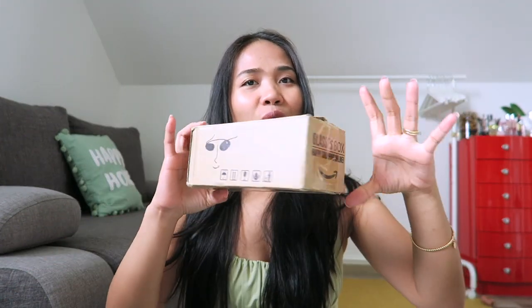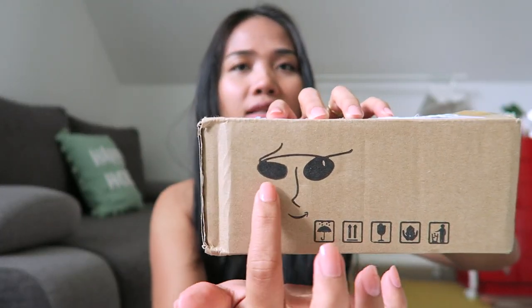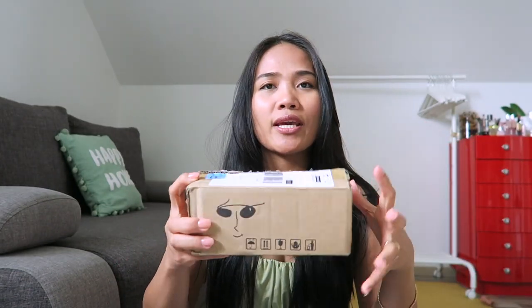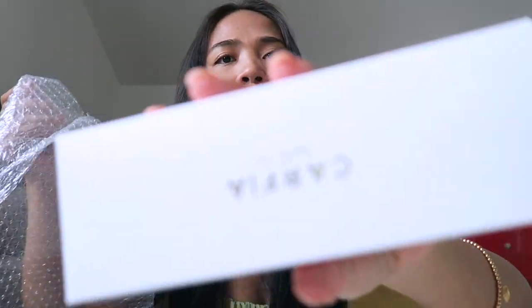Koala AI sent me a prescription glasses and this is the container. I'm just kidding — I already opened it, but I'm just going to show you how they pack it. The box is specifically for eyeglasses or sunglasses so people will know it's breakable. When you open it, there is a bubble wrap. Let's dig in — this is it. They sent me one prescription glasses, and voila, this is the packaging.